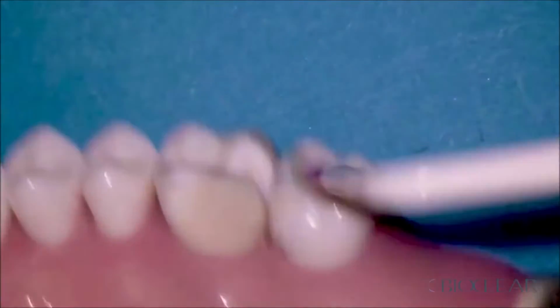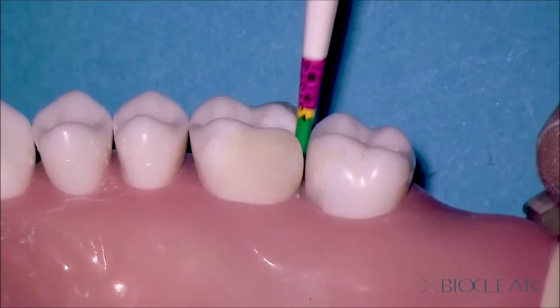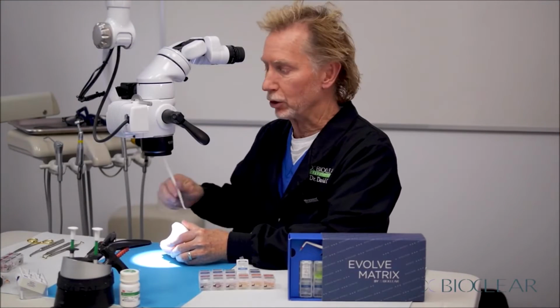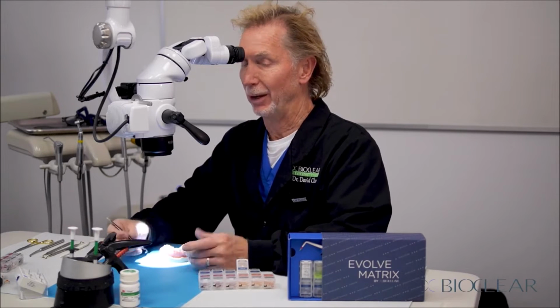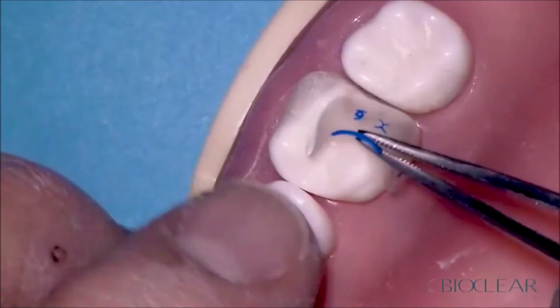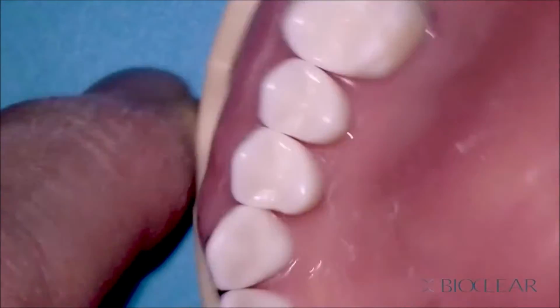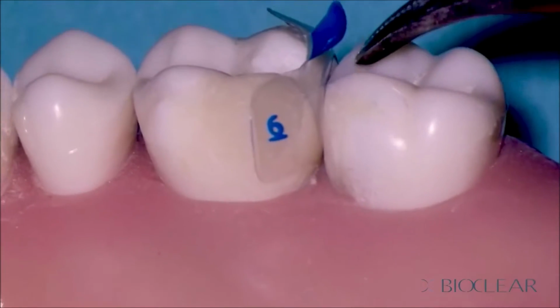So let's take a look over here. When you look at this side, I'll drop my matrix height indicator in here, and it measures once again at about a 4 millimeter. If you look at the marginal ridge of the neighboring tooth, so 4 plus 2, let's pretend it's an adult, 4 plus 2 would be 6. But when I bring the blue Evolve in here, and I wouldn't do this clinically because I would have looked at the x-ray and say, no way is the blue going to have the right contour here. If I bring the blue in here and try and rotate this in, it's a very broad tooth, it's a very flat tooth, there's root proximity, and if you look at this, it's inverting. That's a disaster. So that is the wrong matrix.